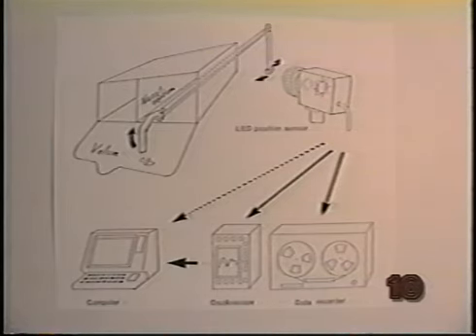A second LED is positioned at the end of the support rod, and a third near the bridge of the nose. These serve as reference points against which the movements of the external lever can be described, including making corrections for head movement. The positions of the LEDs are tracked in two-dimensional space and recorded simultaneously with the acoustic signal and a timing signal on a multi-channel instrumentation data recorder.